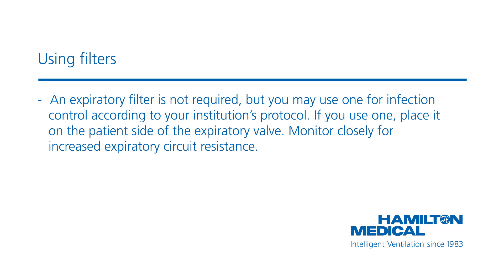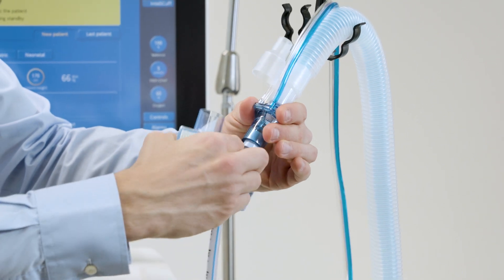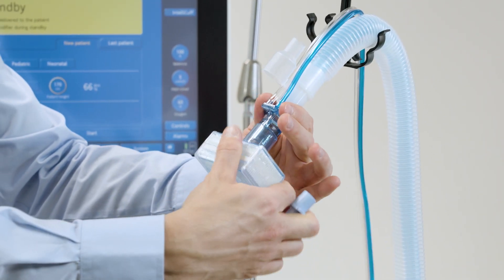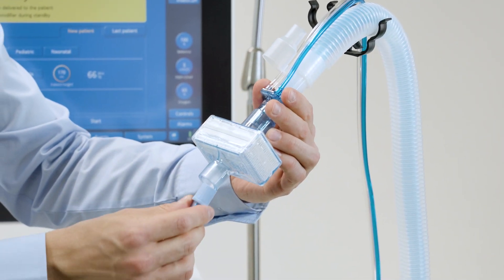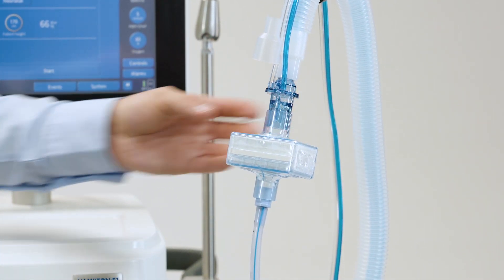Monitor closely for increased expiratory circuit resistance. If you use a coaxial breathing circuit, the only filter you need is a heat and moisture exchange filter. Position the filter between the flow sensor and the flex tube, as described in the operator's manual.